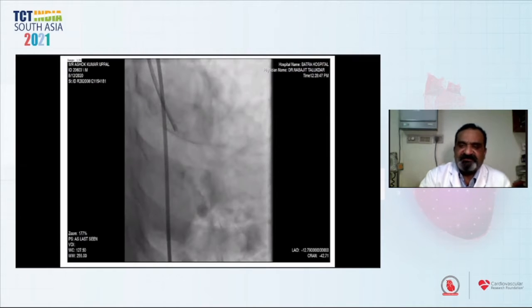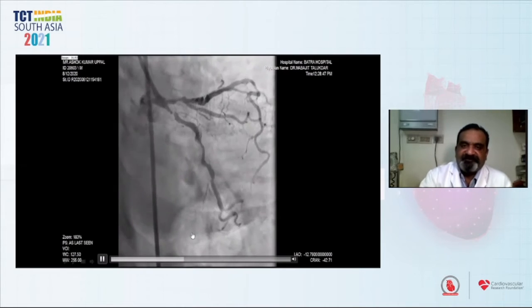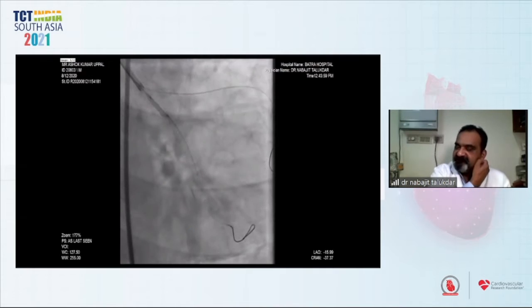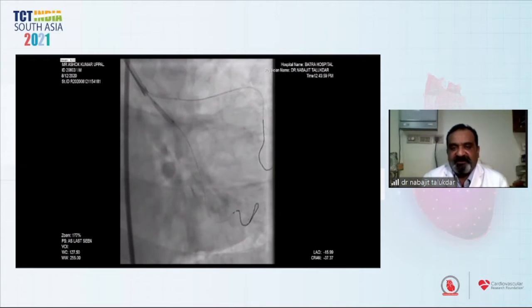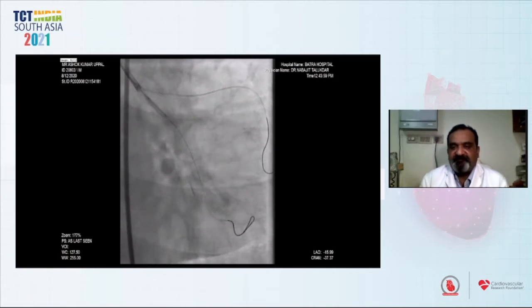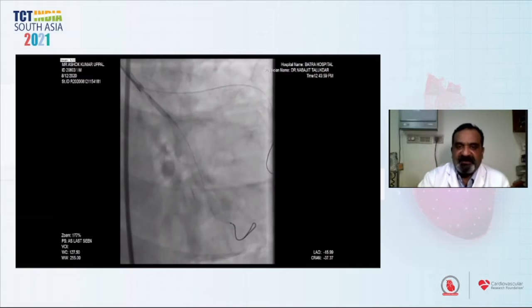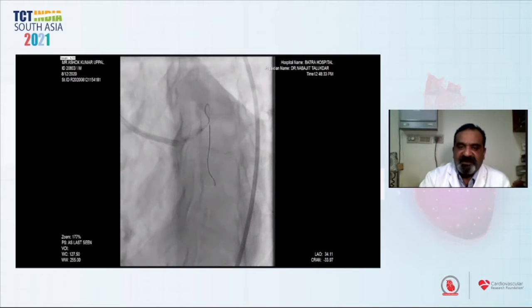We decided to stent it using a two-stent strategy because the circumflex lesion was quite significant. Both lesions were crossed with a workhorse BMW wire, and the lesion in the LCX being more critical was pre-dilated with a 2.5 by 12 mm balloon at 10 atmosphere pressure. Subsequently, the LAD lesion was pre-dilated with the same balloon.